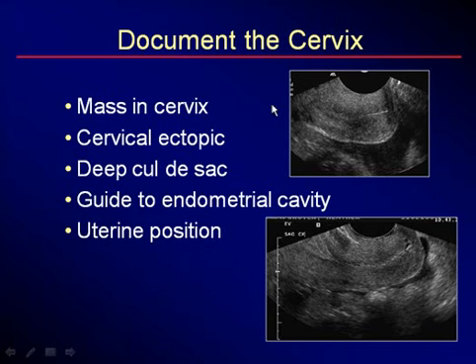So now that we've quickly analyzed the position of the bladder and the appearance of the bladder, we now move to the cervix. You should look at the cervix separately and directly. You want to be perpendicular to the uterus. You want to leave the rest of the endometrium and the fundus and the corpus out of your picture, 90 degrees to your area of interest. This helps you to quickly see is there any kind of mass inside the cervix.